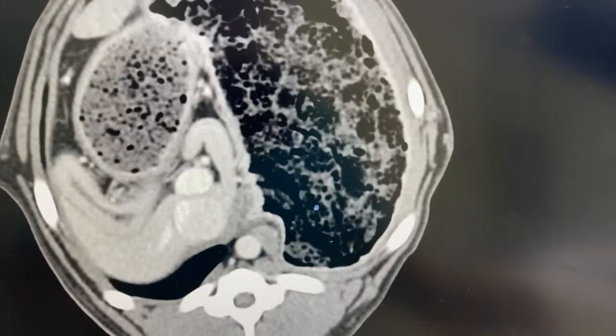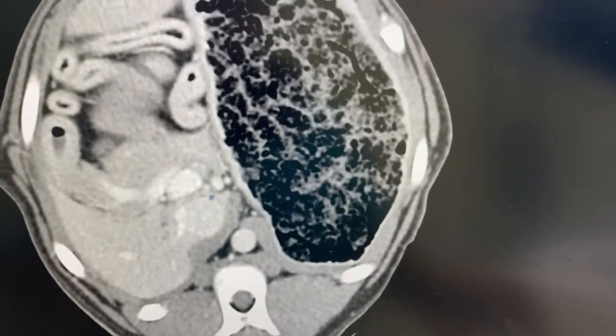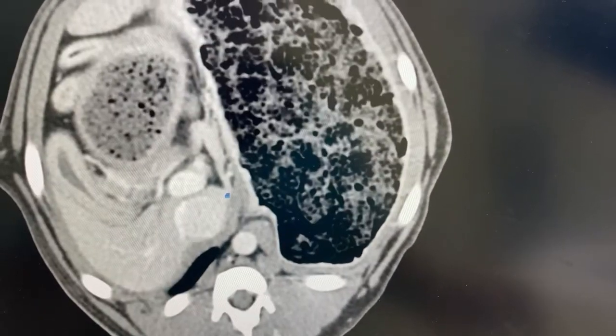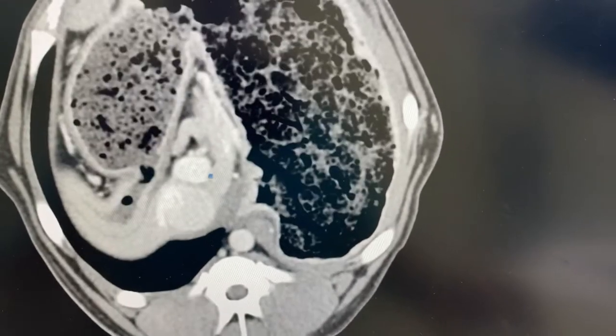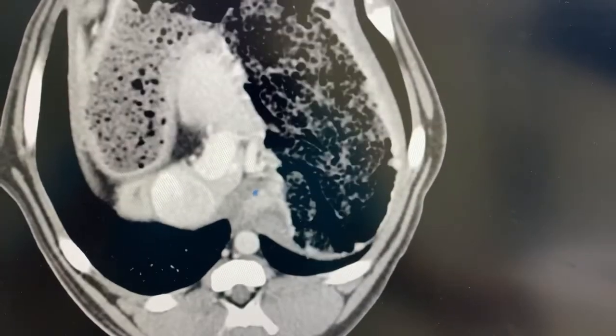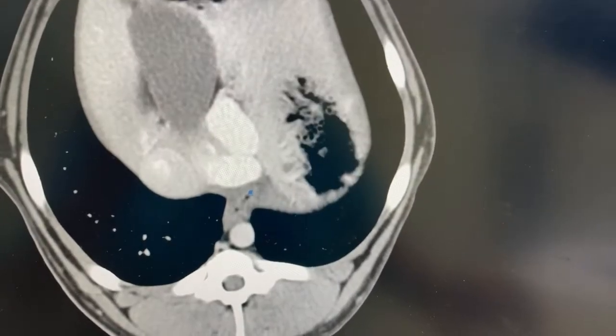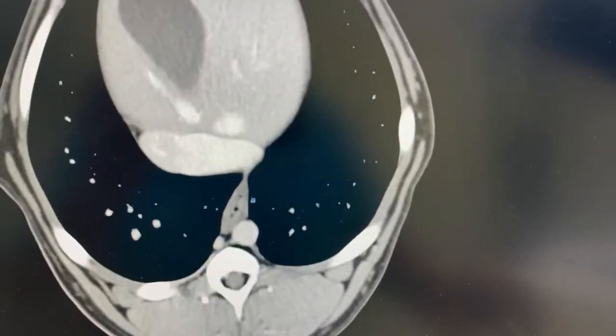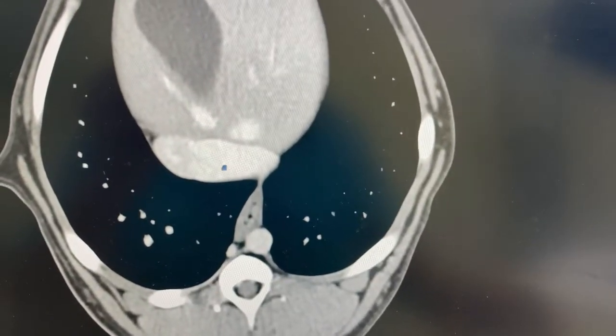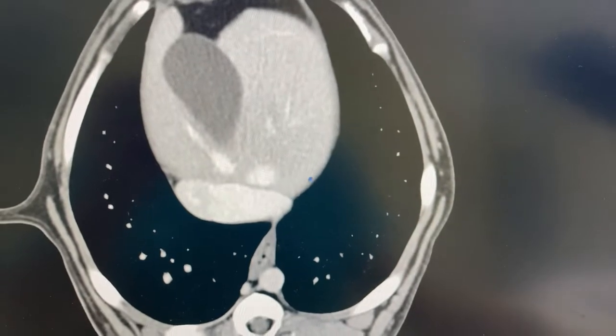That's the caudal vena cava there. So heading back, portal vein. I'm going to head back cranially again and just trace that portal vein right there as it loops around and then comes into the left side of the vena cava. So really big intrahepatic shunt sitting right there.